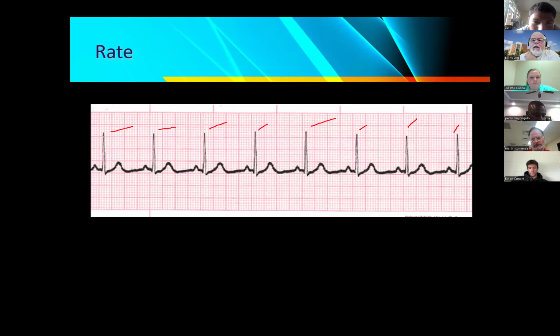Yes. Now, here's the other thing I want to add as part of your P waves. As you're going across on your EKG, you want to compare them to each other as well, as far as answering that question of whether they are normal or not, because we can have certain types of EKGs, and we will jump into these types the week after your exam, where one part of the atria will fire, and then another part of the atria will fire. And the way that we know that is that their P waves look different from each other.